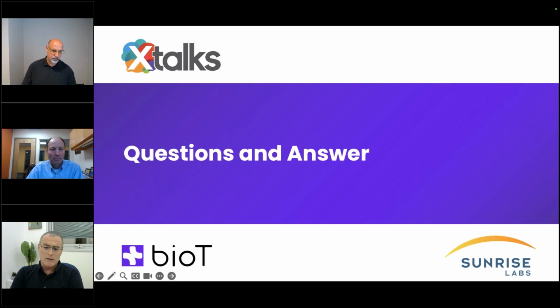But in case you're running algorithms or decisions on the cloud that impact the outcome, like with the Netira example, then the cloud is part of the medical device regulatory submission, and they should come together. Okay, so that's basically how to respond to that. And again, I repeat on the point of the cybersecurity part. These days, you need to submit anyhow a plan on how you are handling cybersecurity. And that's regardless of whether you're already submitting the cloud as part of it or not. Okay, so that's another point.